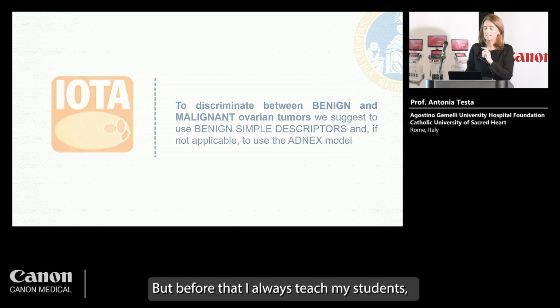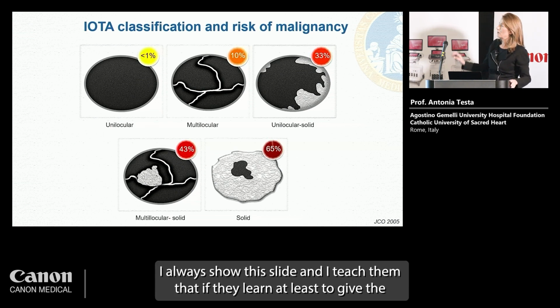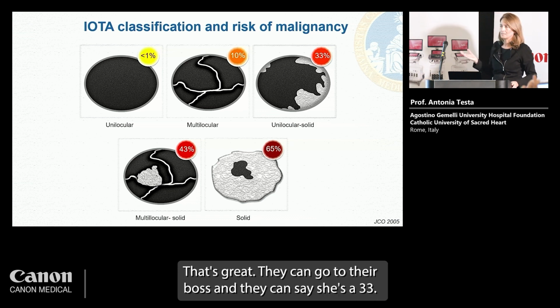But before that, I always teach my students, I always show this slide, and I teach them that if they learn at least to give the ovarian cyst a morphological name, they are able to provide a risk of malignancy. That's great.